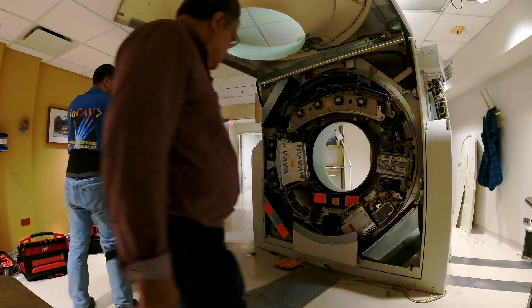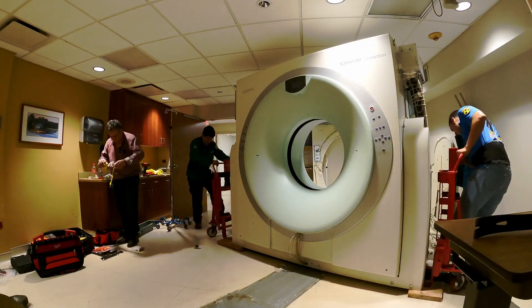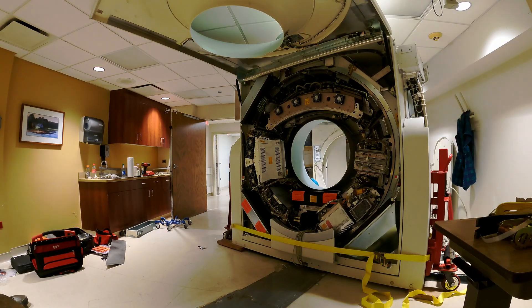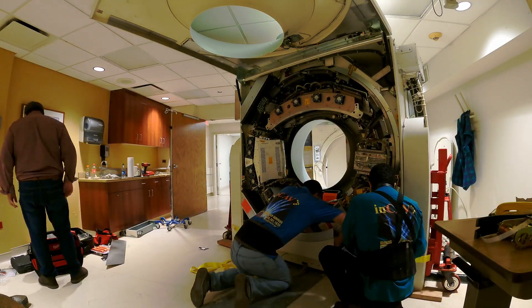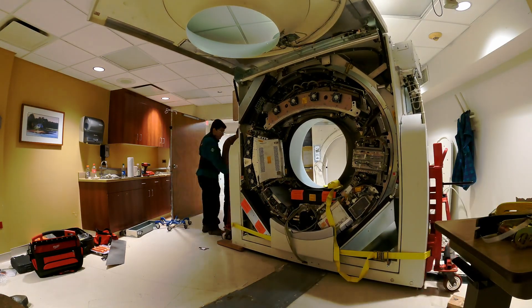Siemens Care 4D Dose reduction is also featured on the Sensation 64, which reduces patient radiation by nearly 70%. This CT scanner is able to simultaneously reconstruct 3D images while also allowing you access to the raw data.